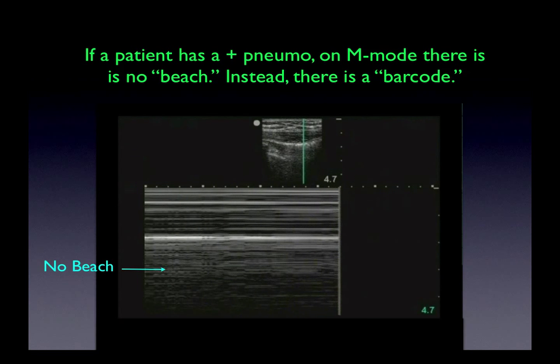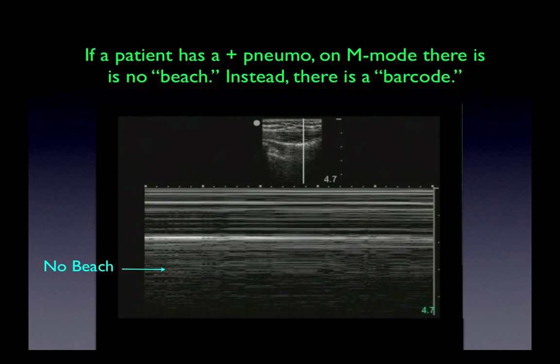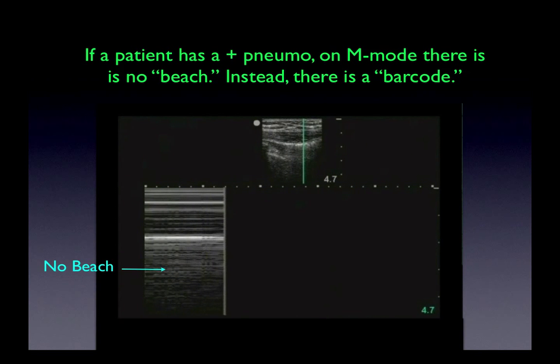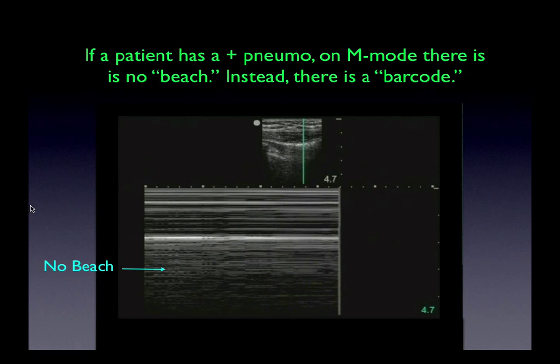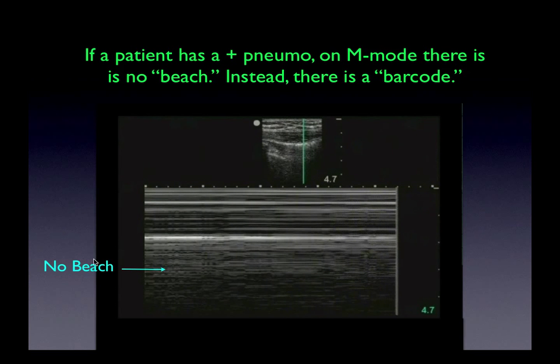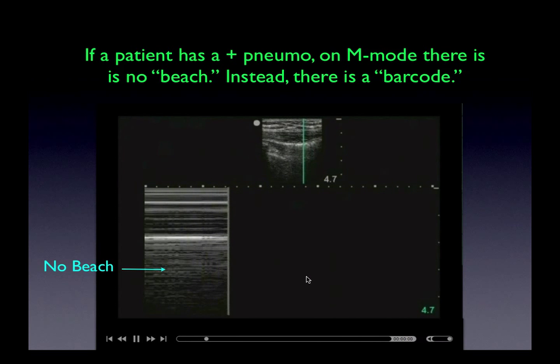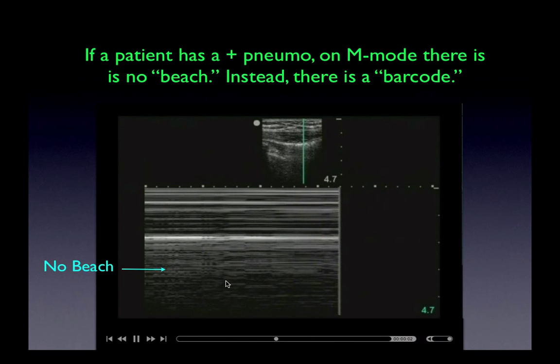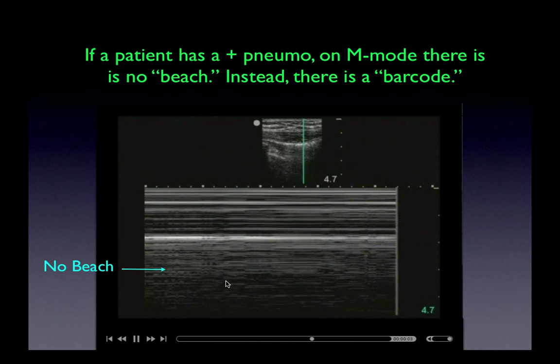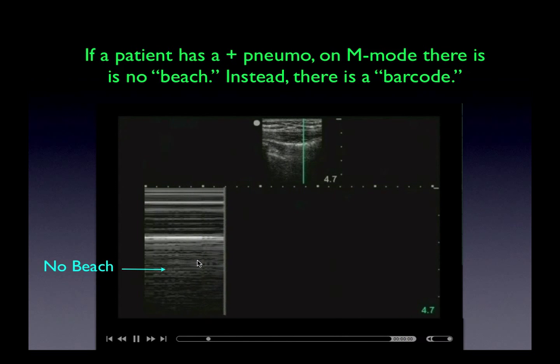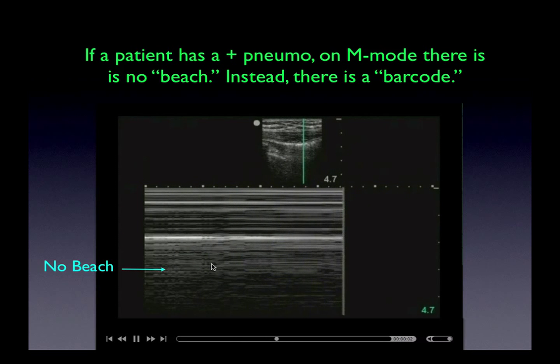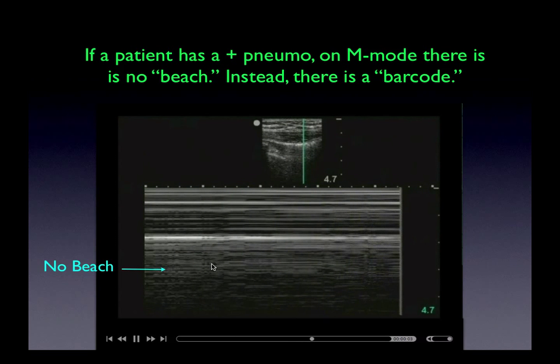Over here, we have M-mode in a loop. What it reveals is that there is no beach — no sandiness, if you will. This has been known as a barcode, and this barcode pattern is typical of someone with a pneumothorax.